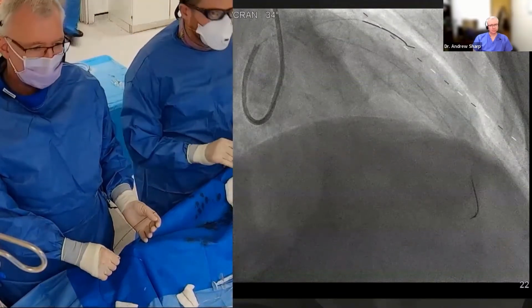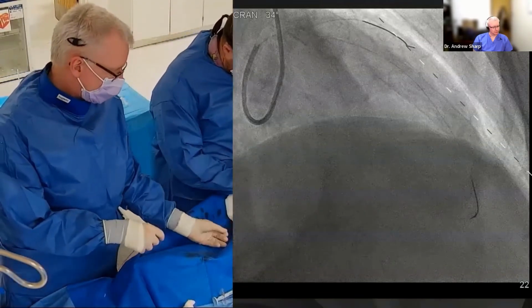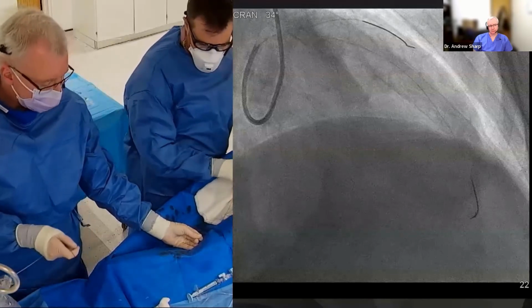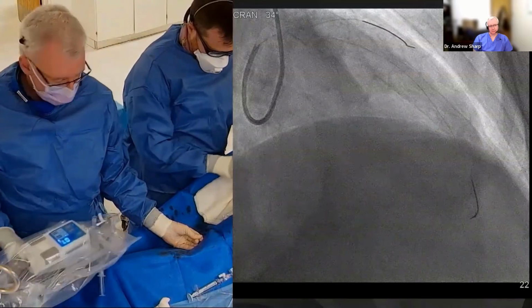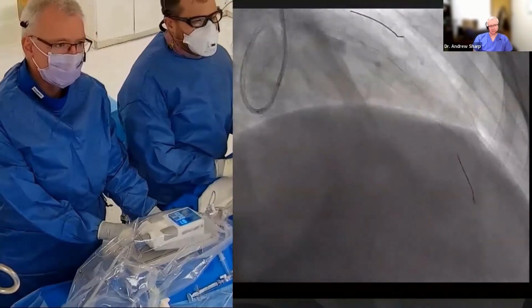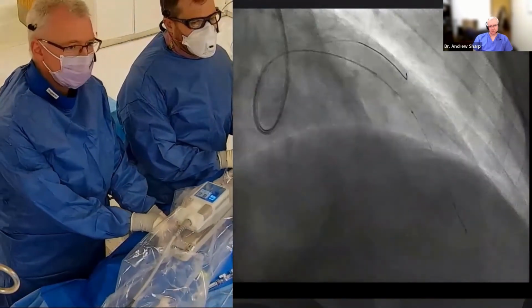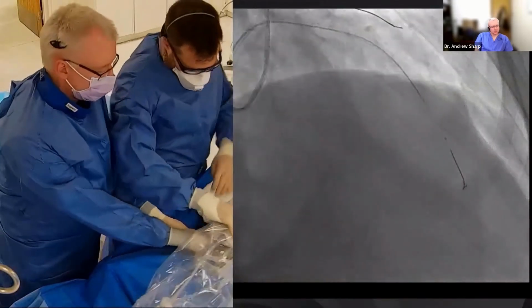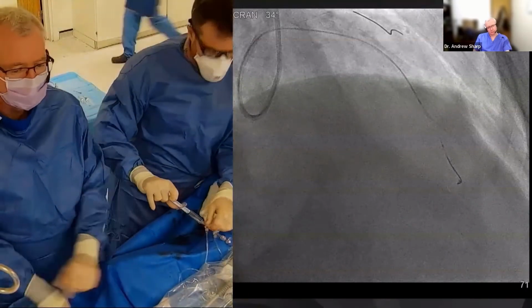So we're using the Refinity catheter for this case. It's a 45 megahertz catheter. It's low profile, and it's a motorized pullback, so we can do length measurements. You can't co-register with this. You can only do cross-sectional measurements where you are, and co-register by going onto the pedal on the angiogram at the time of the pullback. You need to use the Eagle Eye for co-registration, but we'll come to co-registration in later segments of this online series.